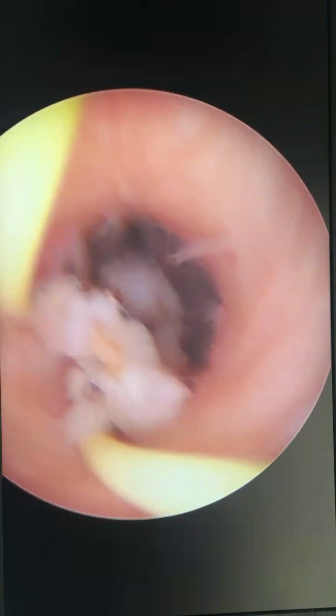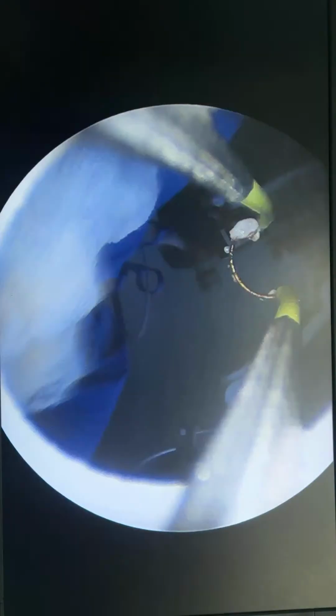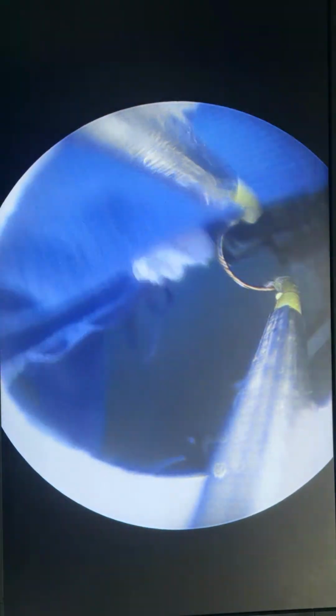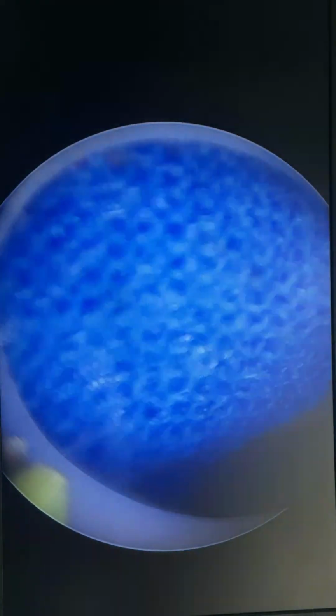So I think I should once clear up everything and see once more. With the TruClear system, the benefit is that we can keep removing the tissue and at the same time it gets cleared mechanically, and we do not need to stop the procedure.